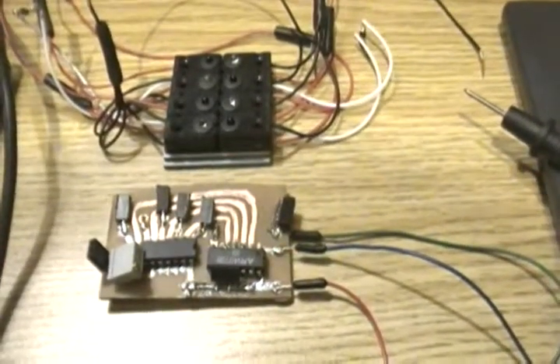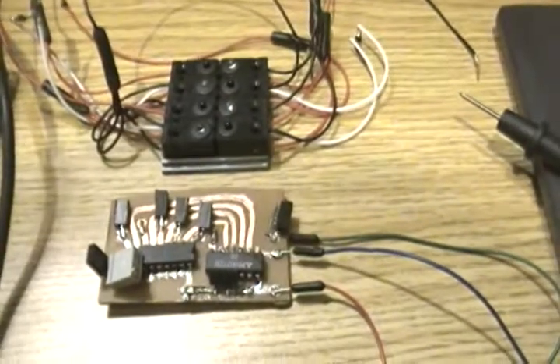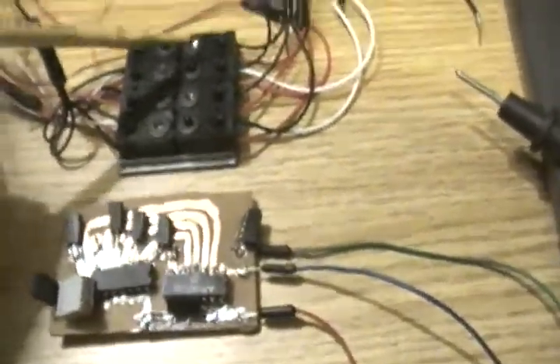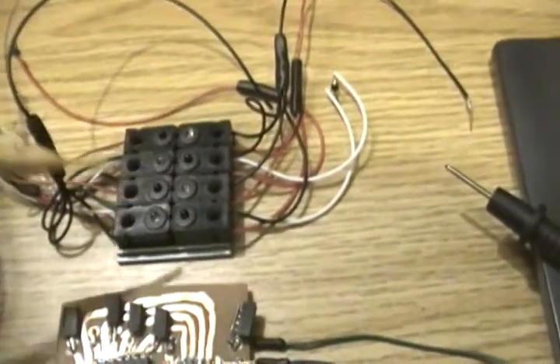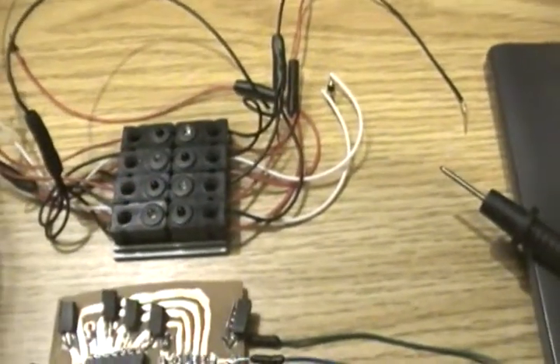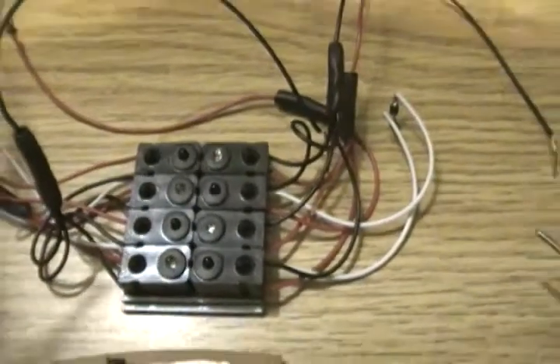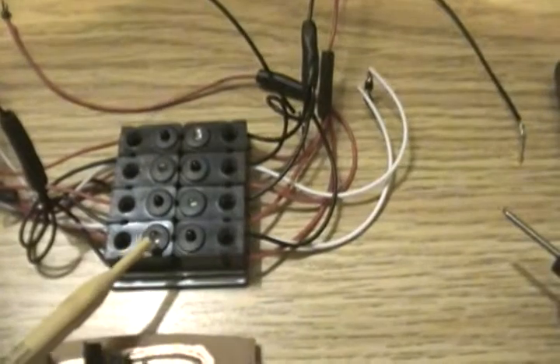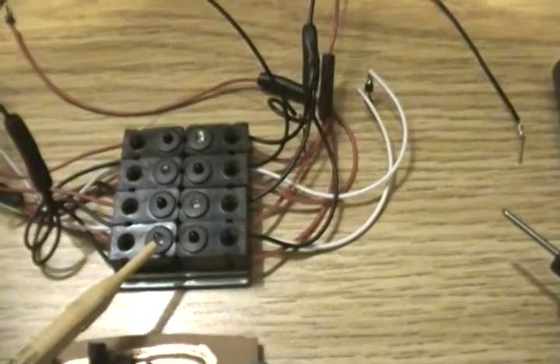I'll show you how to connect the drop sensor. This is a drop counter. What you have here is a series of four LEDs and phototransistors. The dark ones are the phototransistors and the lighter ones are the LEDs.